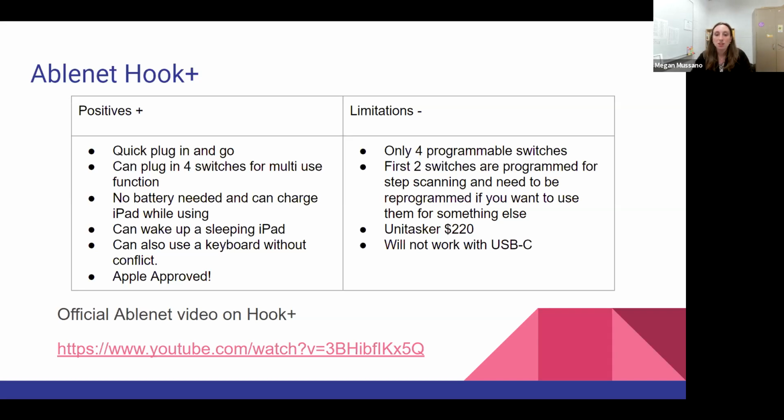One thing I wanted to mention is that the first 2 switches are programmed for the step scanning on the iPad. When you plug it in, I guess this could be a positive too. The moment you plug it in, this automatically sets up the first 2 switches to do that step scanning, kind of like the next, select, which is a great way to scan through the iPad. However, I know that many of my students aren't at the level where they're familiar with that 2 switch step scanning. And a lot of my students have to go back to the cause and effect level. Another thing is that it is a unit tasker.